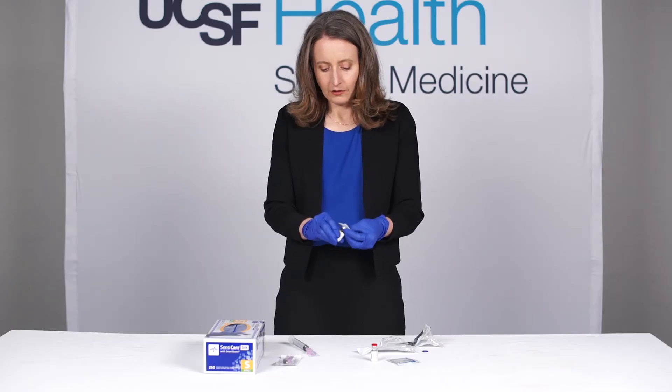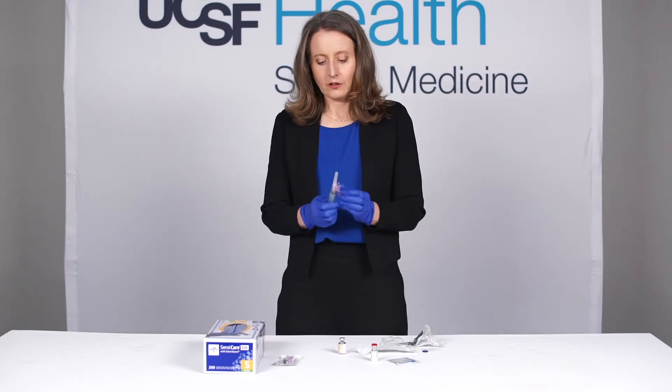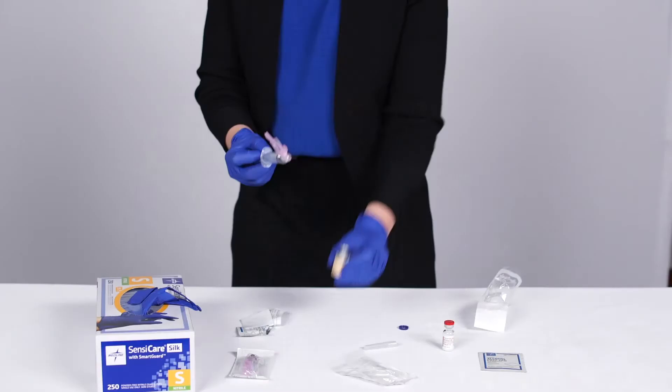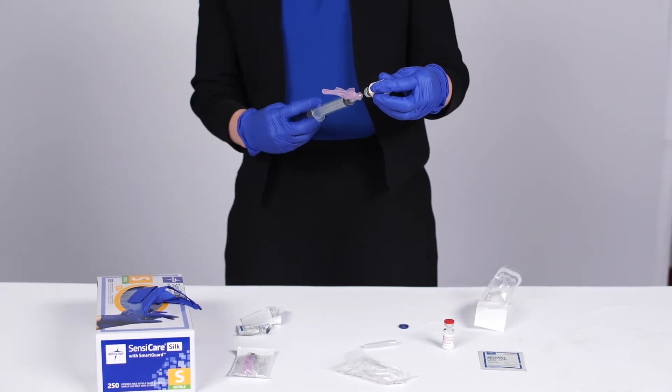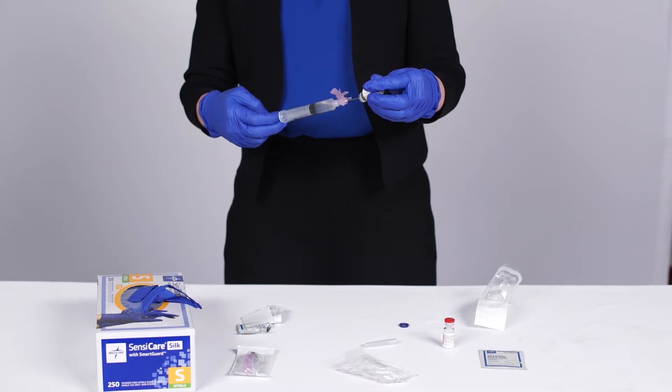This is five cc's of one percent lidocaine. You want to clean that off with some alcohol. Draw a little bit of air up into your syringe — that'll make it easier to draw up the lidocaine. Then draw the whole amount into your syringe.